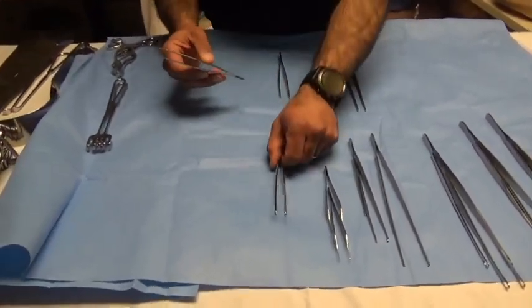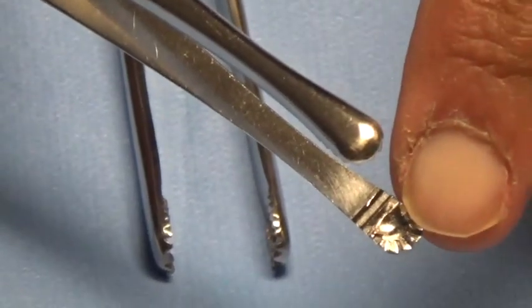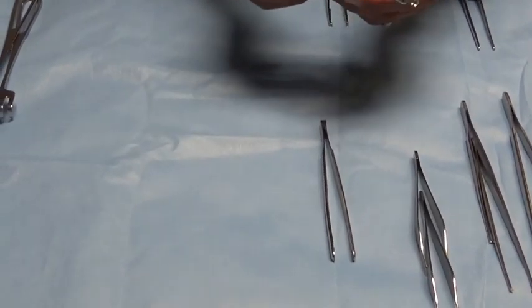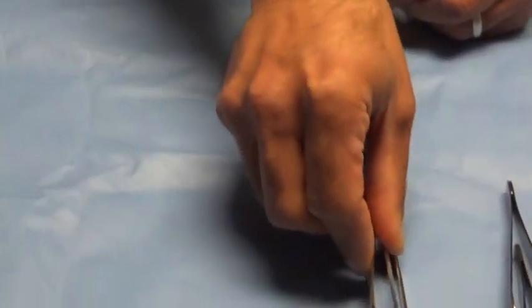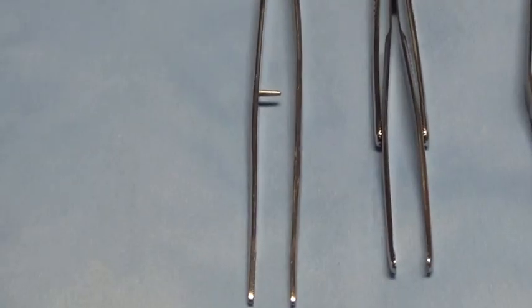The next set of forceps are called Russian forceps. Notice the Russian forceps have a rough surface and a small cupped surface at the end — it's really a cupping and debriding type forceps. Russians are frequently used to remove clots, evacuate loculated purulent fluid from abscess cavities, or scrape out abscess cavities. These are short Russians; they do come in a long variation as well.